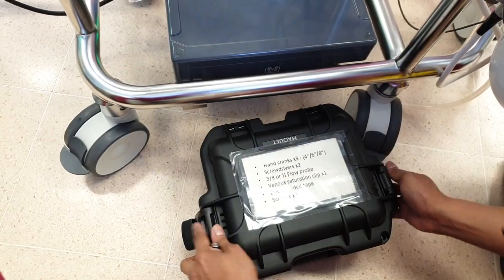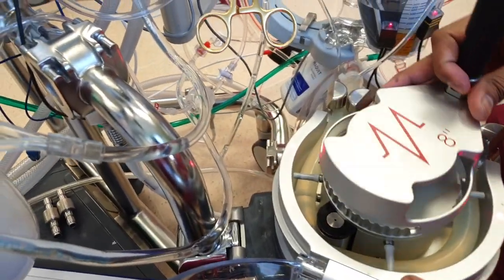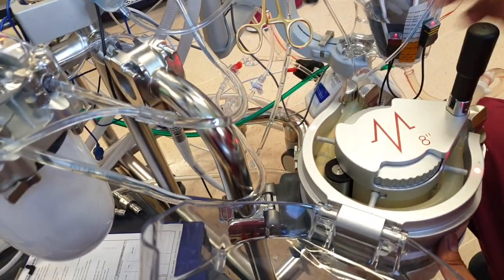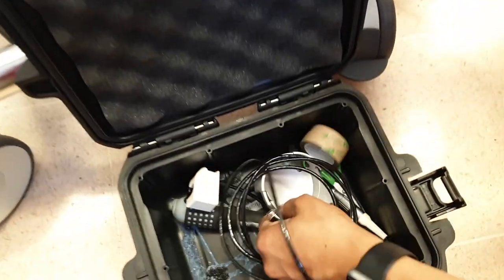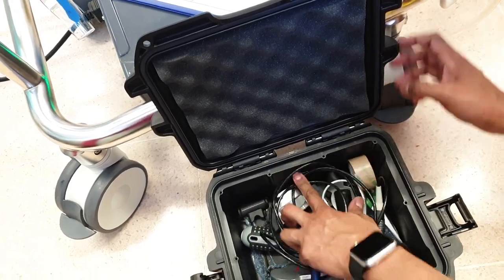Lock box. Open it, and you will find the crank handle here. This is the 8 inches for your main pump. It should go like this. See that? Then turn it at whatever speed. You know that this is not fail-safe; it can turn in the other direction. The others come in 3 sizes: the 6 for this, and the 4 for the smallest, the 4 for the small, for the cardio, please. It's in the box, along with an extra flow probe. That's all in the box, and your tape.